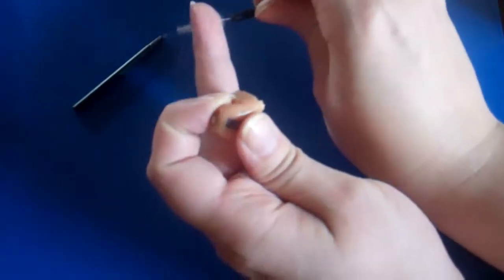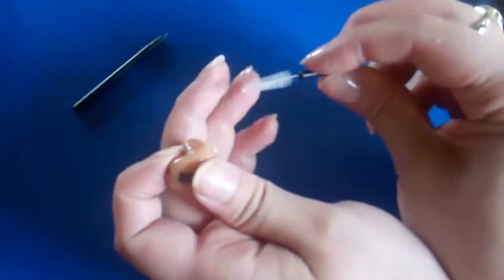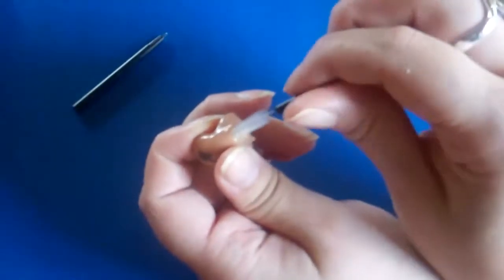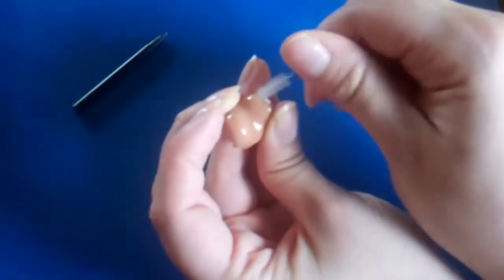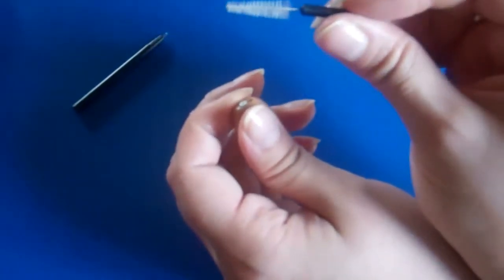The second piece, for the exact same reason, is this little guy that looks like a mascara brush. Now, you don't want to push this all the way through. However, if there's a little bit of debris at the top or a little bit of debris at the bottom that you want to clean out to make your hearing aid look nice and clean, that's what this little brush is for.